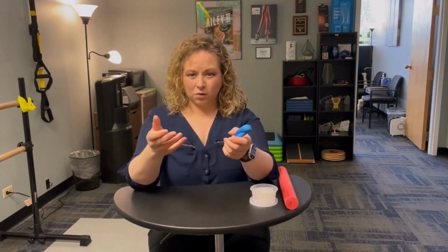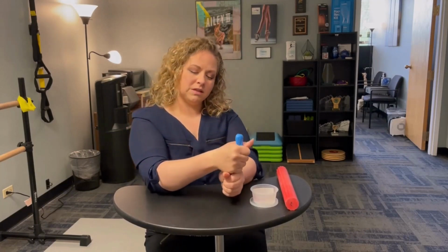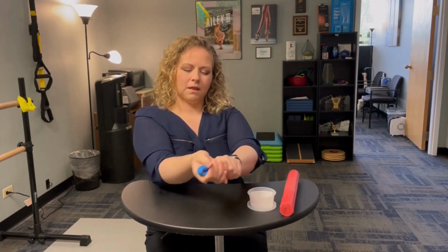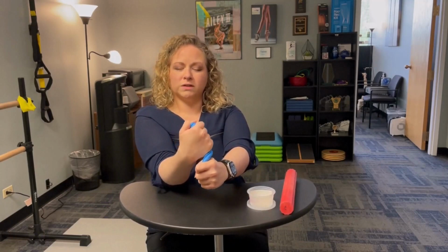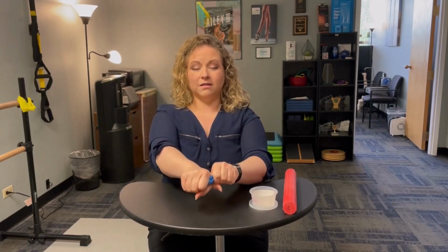I can also take this, and much like some of the wrist and forearm exercises that you saw in the other video, we can do things like pulling up so that my wrist is going this direction. I can pull back of hand up, palm towards me, or angling out to the side.